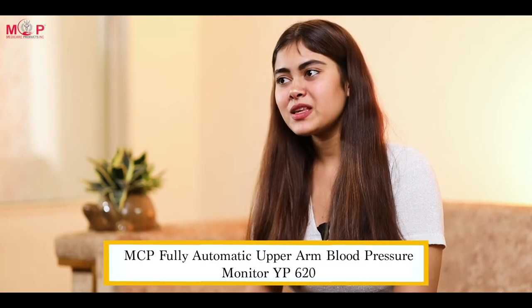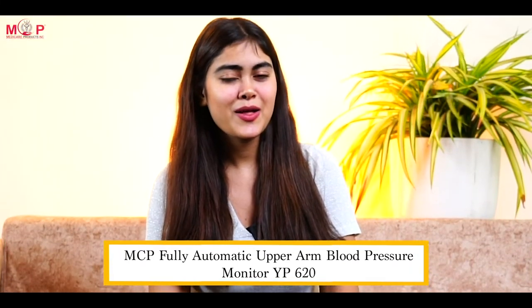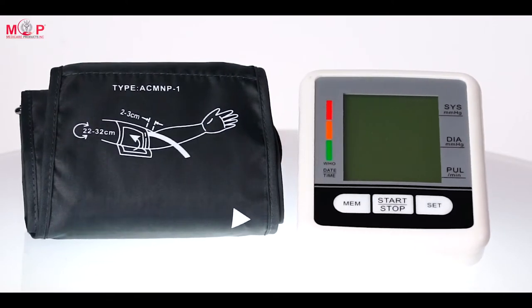Are you facing regular unsteady blood pressure? Are you fond of extreme accuracy but tired of using manual BP machines? Worry not, as we've got you covered. Introducing the MCP fully automatic upper arm blood pressure monitor YP620 — know about your health with extreme accuracy and less effort.